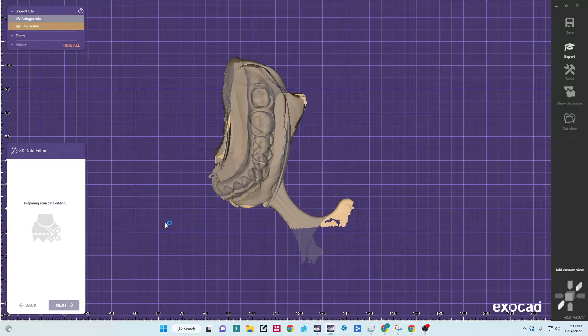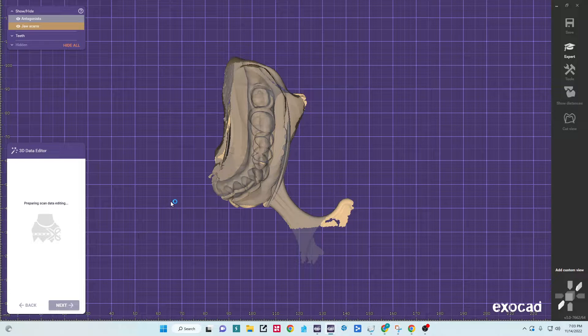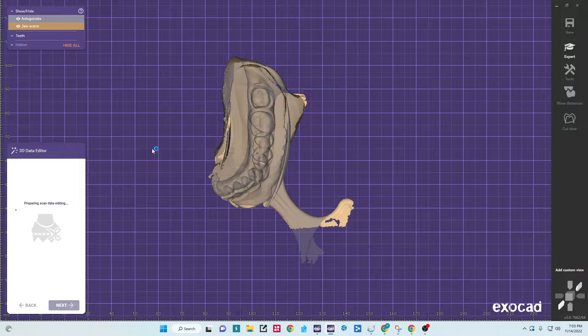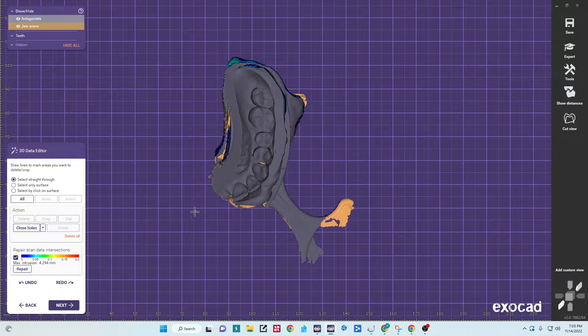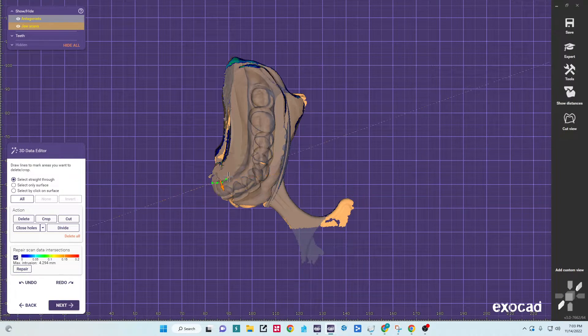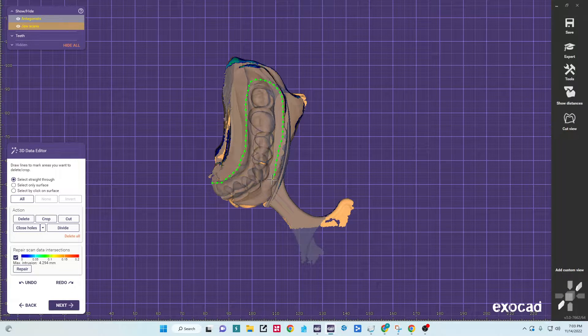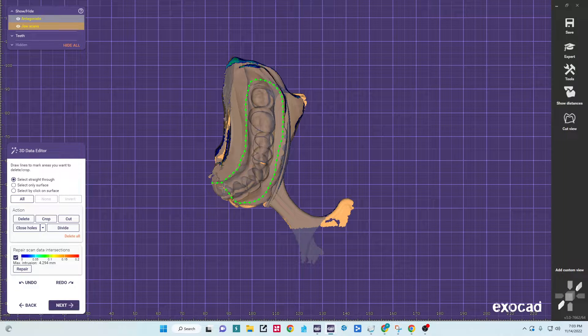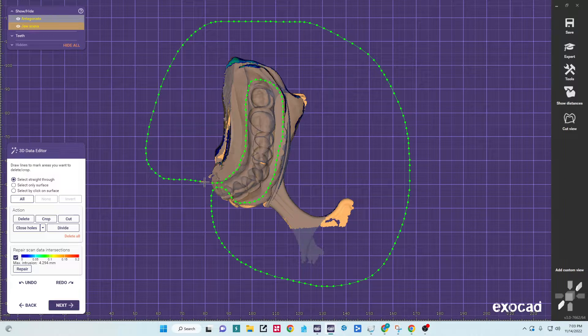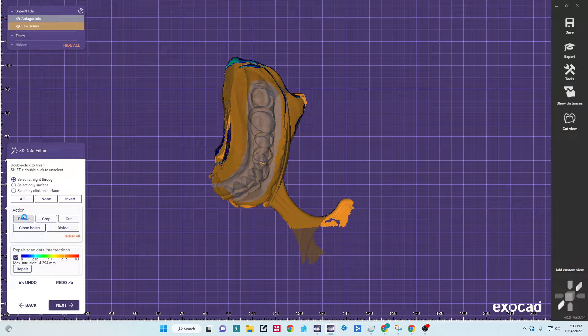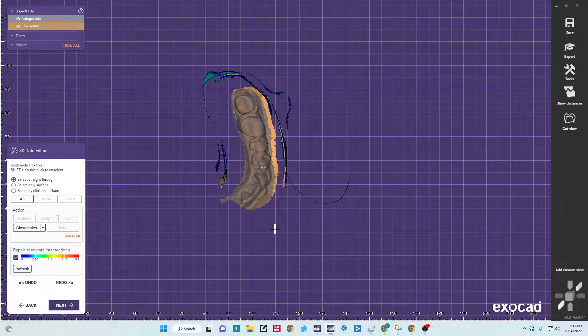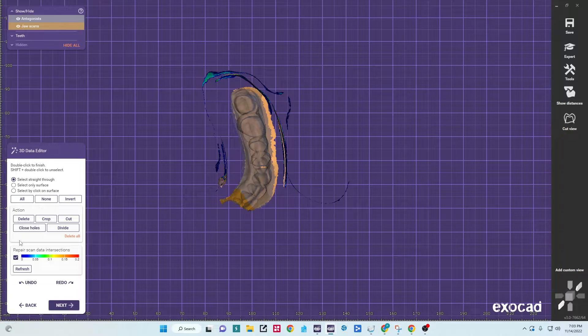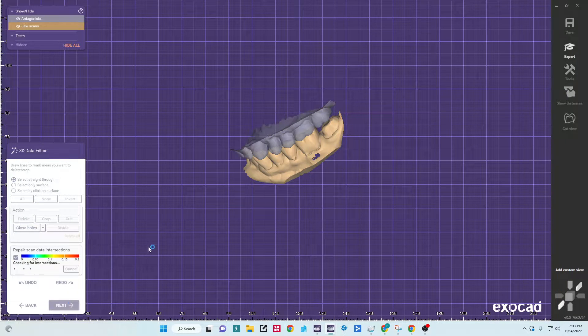So we'll actually cut that data away. Select straight through, then I'm going to trace my data, delete, and that should leave me with just the portion I want.